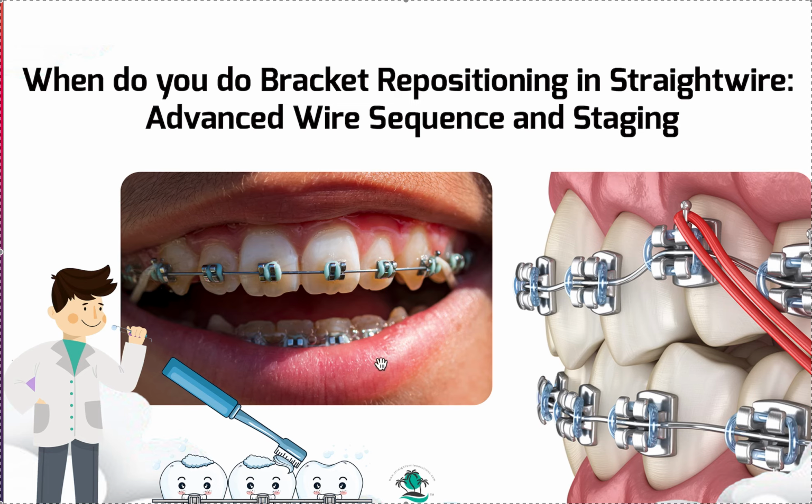So if it turns out the roots are parallel, I'm going to say, hey, this is just wear. We can do a fill here afterwards, or you have some pretty long teeth, so we might just be able to smooth them down. But that's why you want to have that conversation at that point, because if the patient did want the bracket repositioned, I'd rather know then, so I'm not losing time, than at the end.